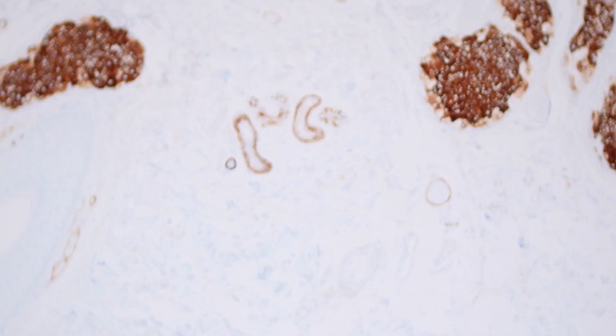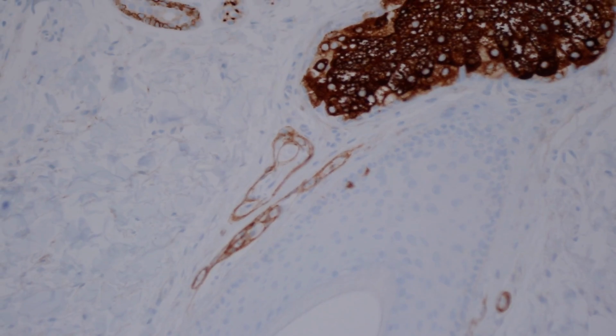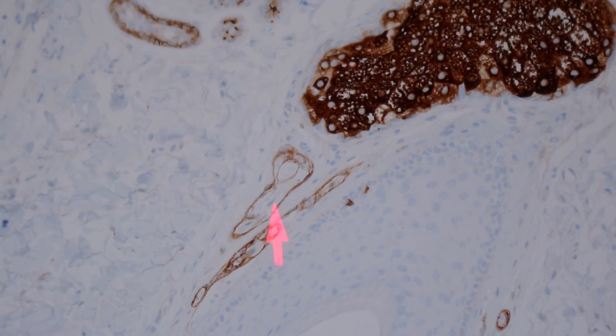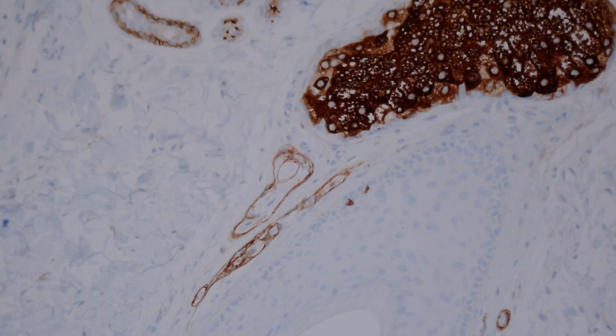And so you're often going to find some nerves in most pieces of tissue, unless it's a very small piece of tissue, and the nerves will have perineurium around them, and you can use that as your control. So here, right next to this follicle, these are a couple little nerves here, and you can see that they're outlined by EMA. Claudin 1 and Glut 1 are two other stains that nicely stain perineurium as well.